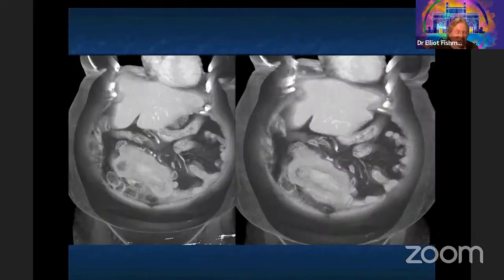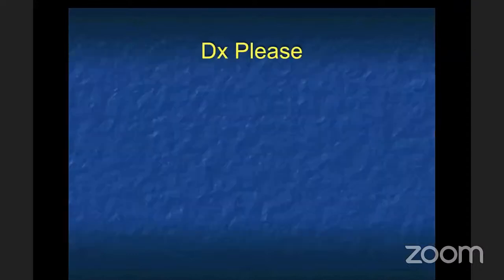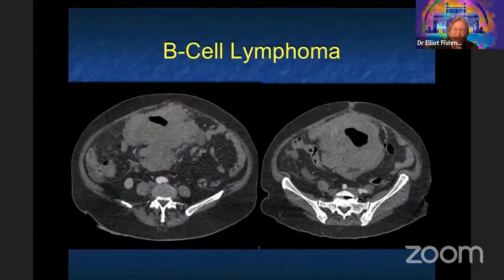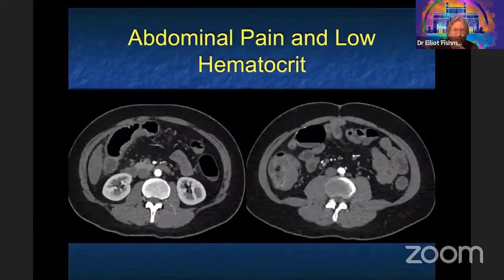Another patient with abdominal pain — similar but different. Answers: GIST and lymphoma. This was B-cell lymphoma — it's much bulkier. The bulkiness is one of the helpful distinguishing features. You often see nodes with lymphoma, but not always. Small bowel lymphoma — very good.